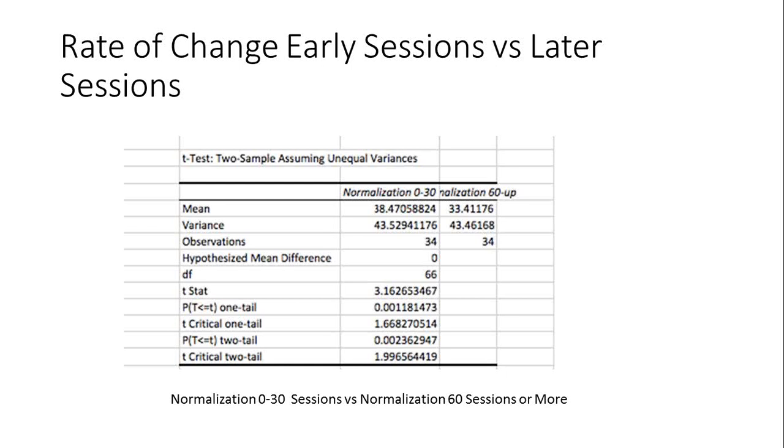And when we compared that, again, we found people who had higher metabolic scores tended to change along the same lines in terms of brain changes. Now, that didn't mean they were the same. This group that was on 60 and up had higher metabolic scores. And you can see that even at 60, the rate of change was still around 33, whereas the group that had lower metabolic scores in the 0 to 30 range had changes around 38. That's a pretty good difference between 38 and 33, but it's not enough to make a whole standard deviation, as I pointed out in some of the previous slides.